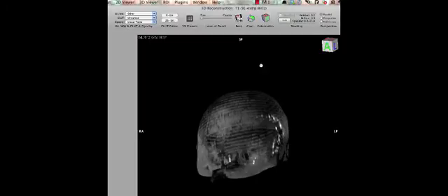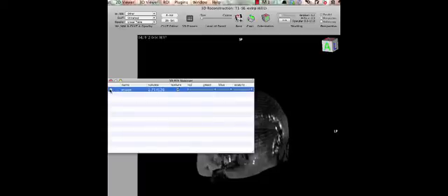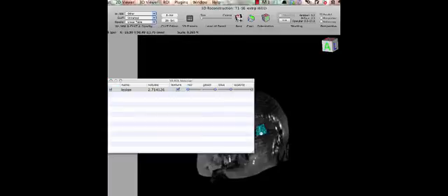So we still need to impose our lesion into this model that we have created. To do this you need to go to ROI, then click on ROI manager. And then you will see the lesion. Then you click to check this lesion. So that will prepare the 3D. Now you can see the image.